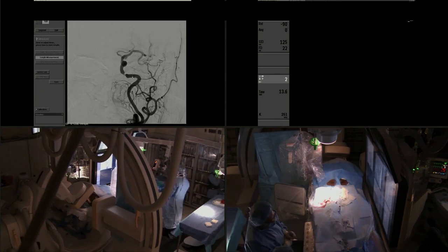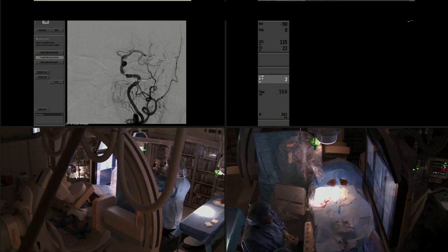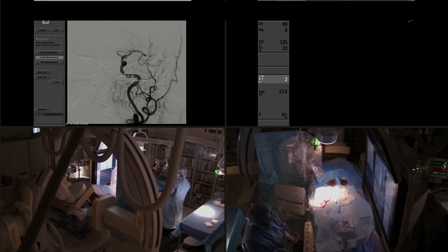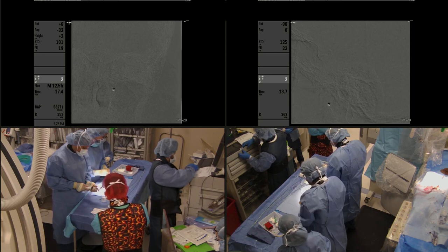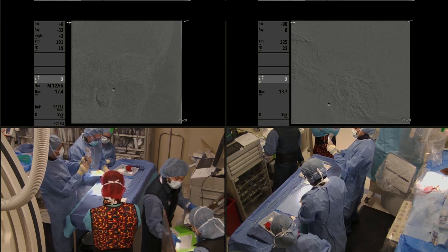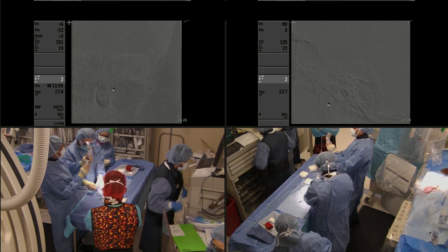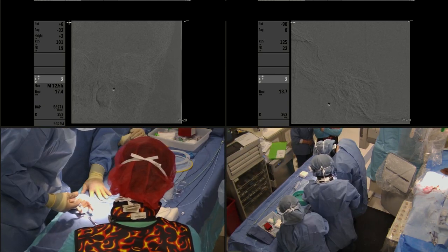After we get to position, we are able to do measurements and determine the size of the balloon and stent that are going to be used for revascularization. It was 90% stenosis, and we decided to use a Gateway 2.5 millimeter by 15 millimeter balloon, which was advanced over a Transcend 300 centimeter microwire.